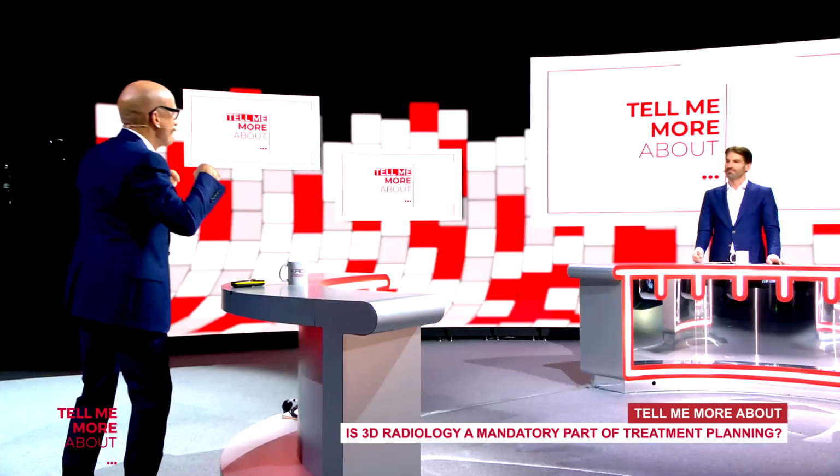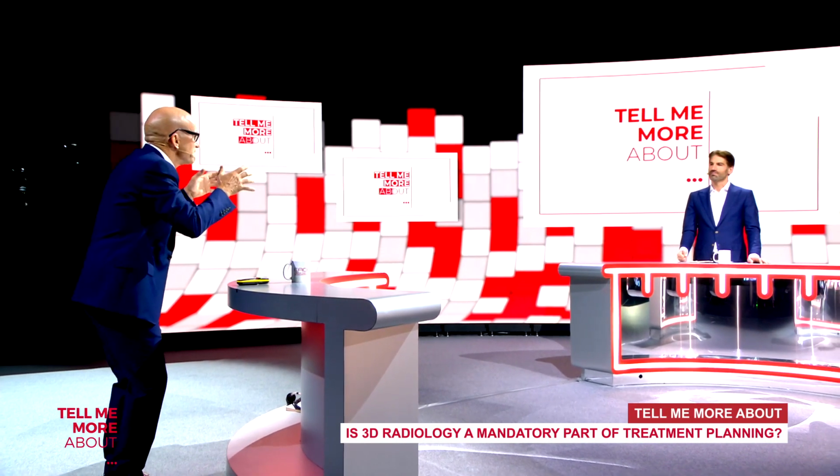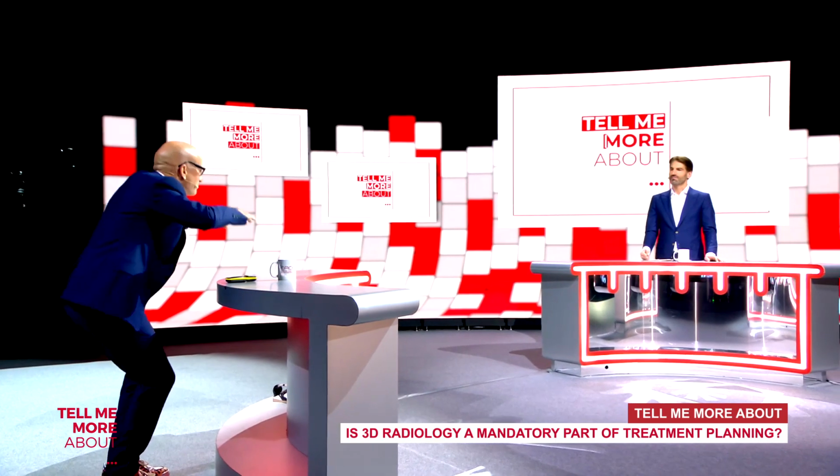There I developed a new technique in the burring protocol. I do a different burring protocol, which we have learned from the sinus lift. When we do a sinus lift internally, I go with the small burr till I see a little bit below the point, this is the sinus. And then I first open the implant bed with a wider burr at the top, and then I go closer and closer stepwise. So I do the burring process differently when I do an internal sinus lift. There I also have to go as close as possible to the floor of the sinus to hit it later on. I do the same thing today when I place implants as close as possible to the nerve in the lower jaw. I prepare with the 2 millimeter and then I open first, and then I go step by step, widening deeper, deeper, deeper. And then I get better control.